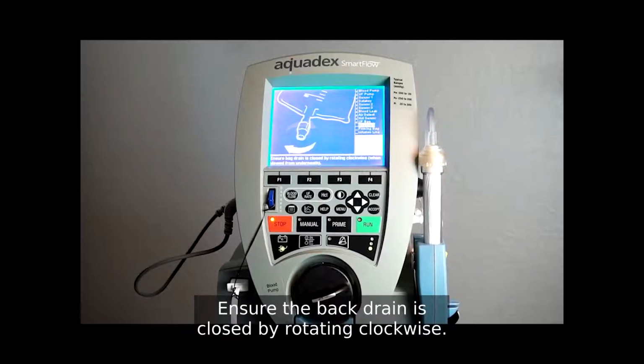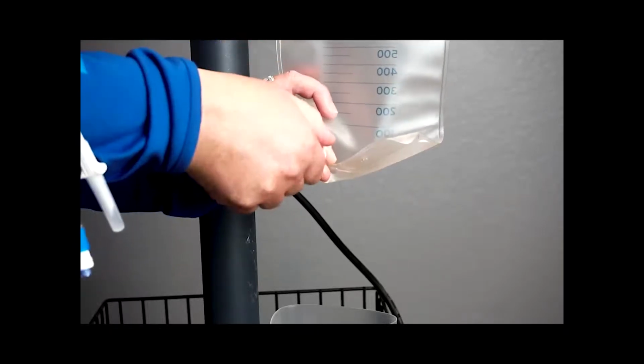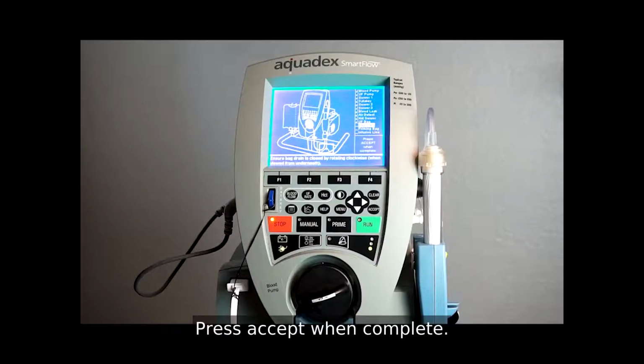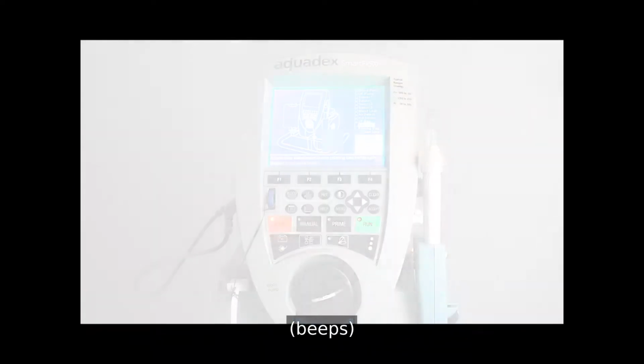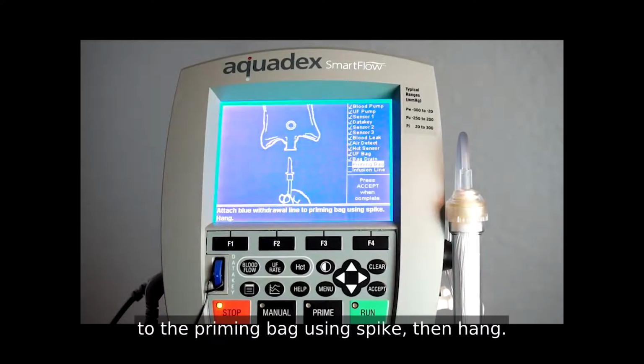Ensure the bag drain is closed by rotating clockwise. Press Accept when complete. Attach the blue withdrawal line to the priming bag using spike, then hang.